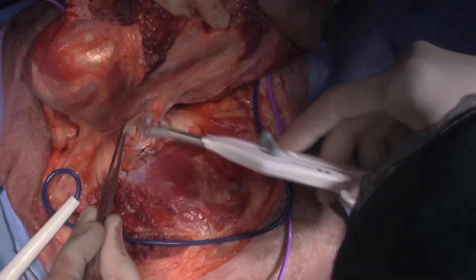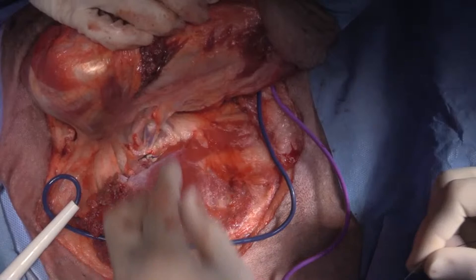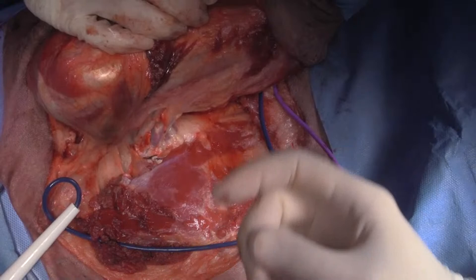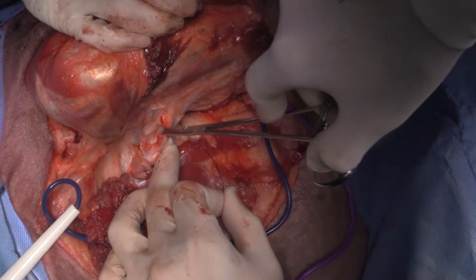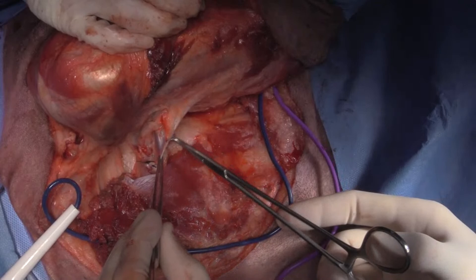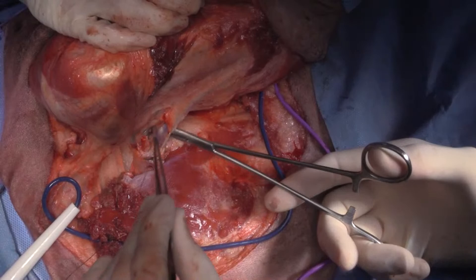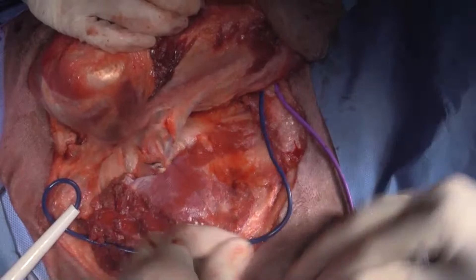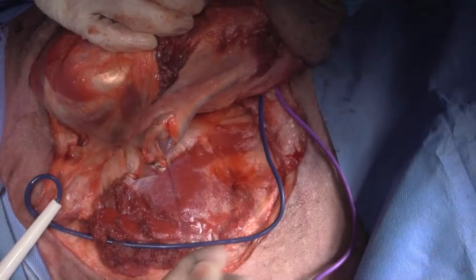Someone asks if LigaSure is not adequate for large vessels. LigaSure is supposedly for vessels up to 7 millimeters in diameter, although I certainly would not trust it for anything that big — it's just so catastrophic if it bleeds. Ishan asks about scapulohumeral disarticulation and whether keeping the scapula protects the thorax in trauma cases.